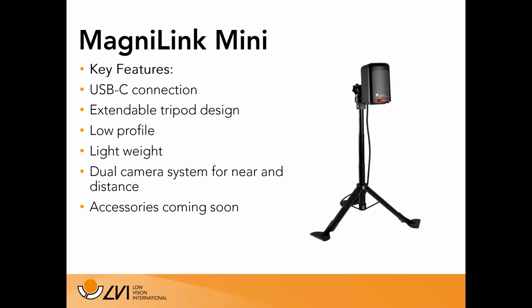We have had some people ask for some accessories, maybe a clamp where you can insert that tripod into a clamp to reduce footprint on a desk, and we are actively looking at that, and I expect to have an announcement about that coming soon.